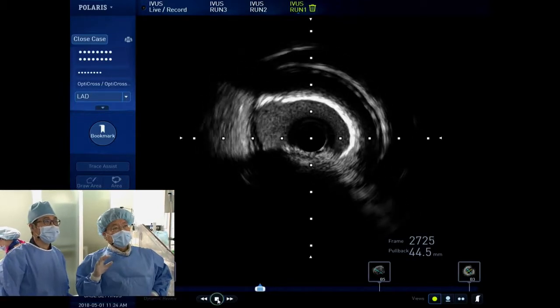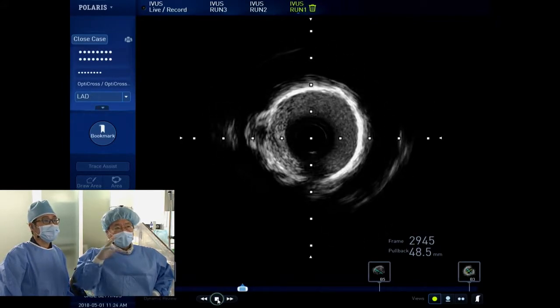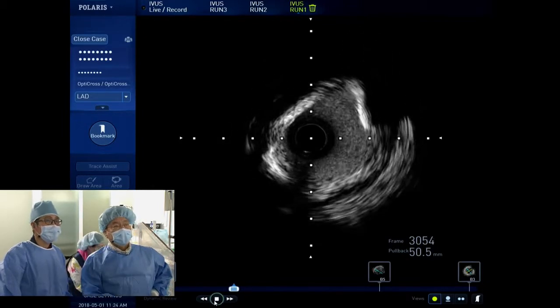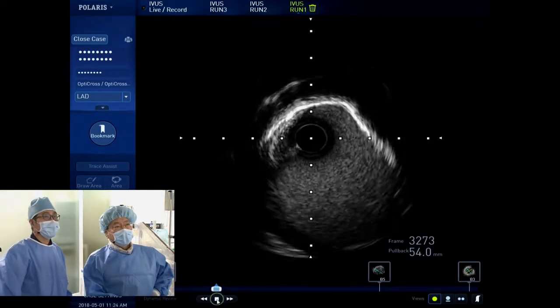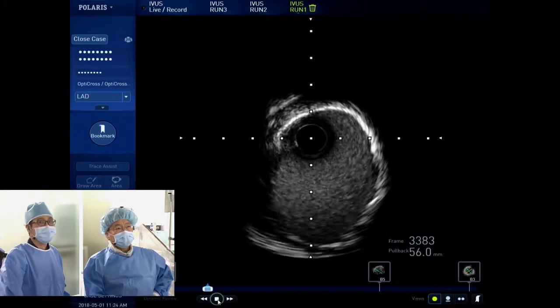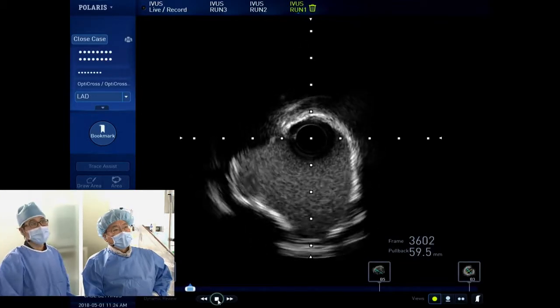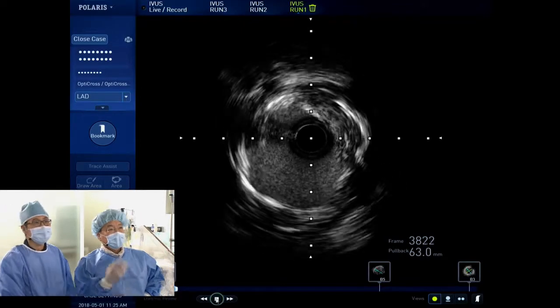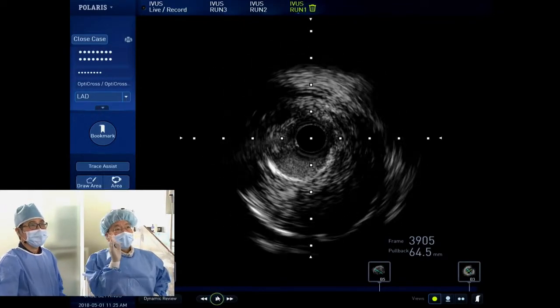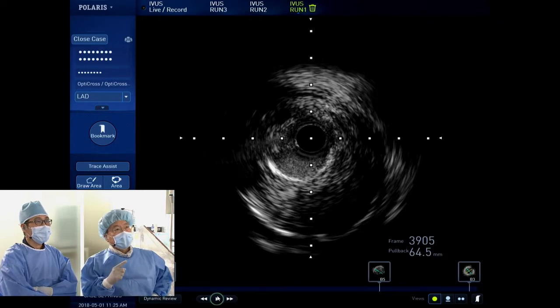All right, big vessels, more than 4 millimeters. This part is truly encircling calcium. The minimal lumen diameter is almost 3.0. The circumflex comes in from 4 o'clock. This is the distal main. Still encircling calcification. All right, so I want to see what happens in this one. Stop. This is the ostial part of the main; it has pretty much plaque and not too much calcification inside, and the vessel size is almost 5, more than that. Okay, go ahead.